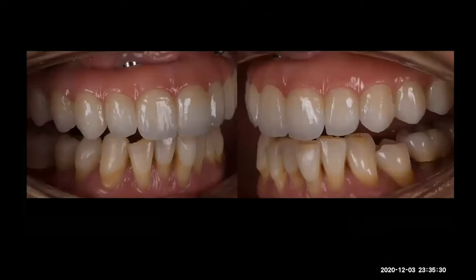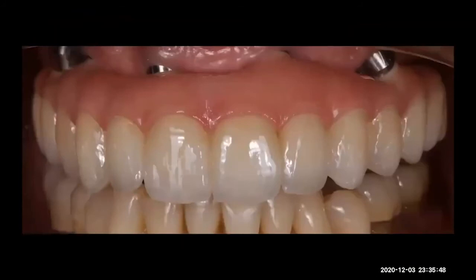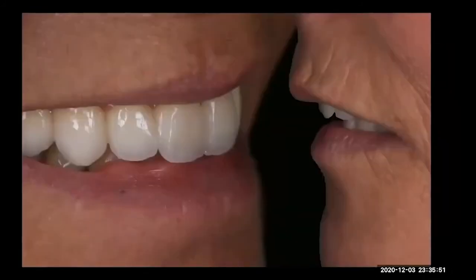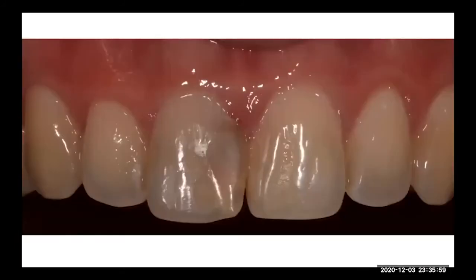Okay, but the important tip here is you need to use the same colors with ceramic that you use in stains, so you can create movement. Okay, this is another view of the picture. This is the restorations in different movements, different positions. Teeth look individual. Okay, but let's say that making a big case is not easy, but it's less hard than making single crowns.